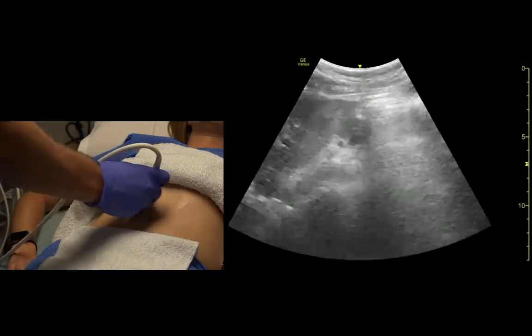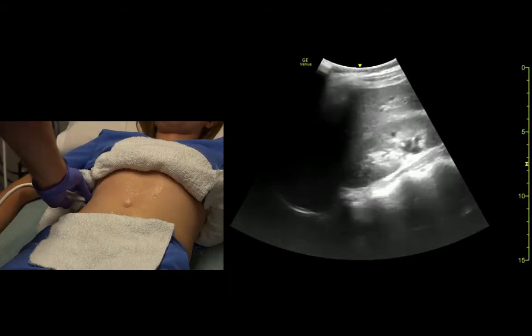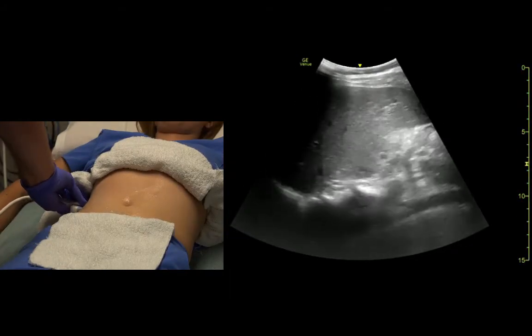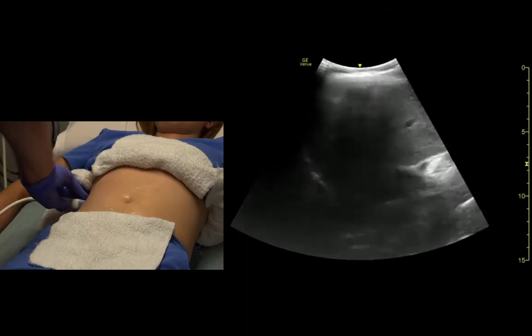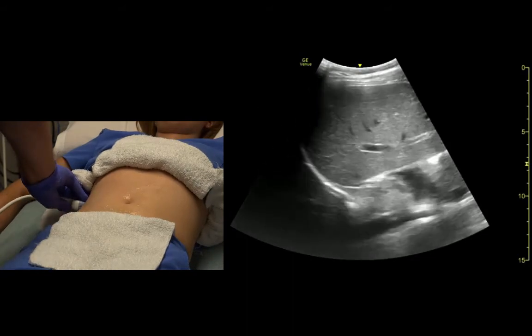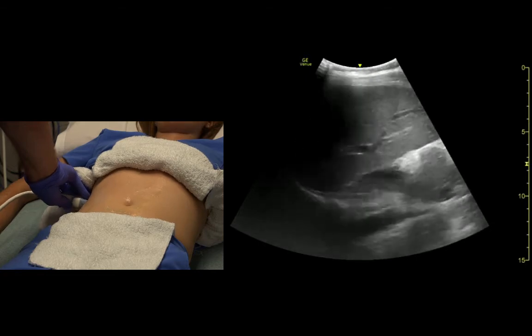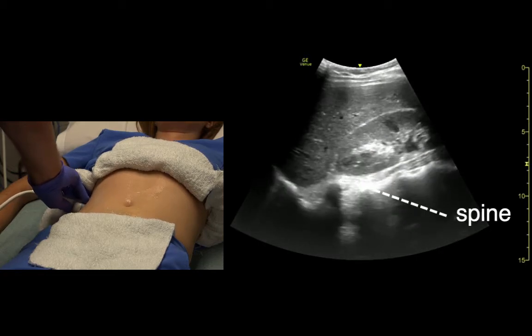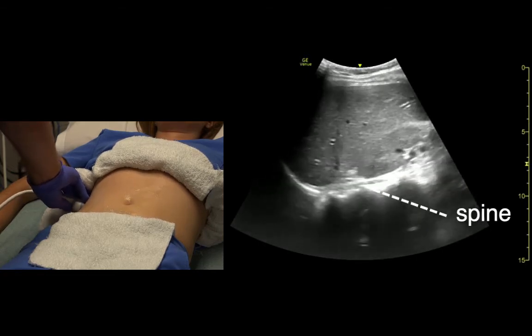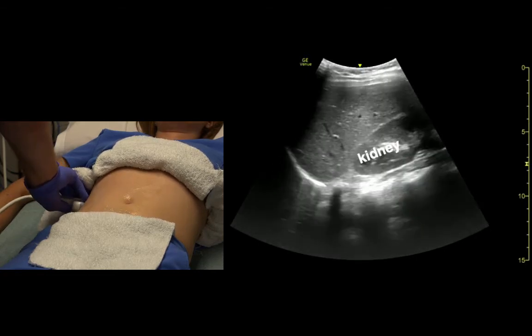We'll point out potential spaces again: the subdiaphragmatic space. We see the spine — the spine should stop at the diaphragm — the kidney, and Morrison's pouch.